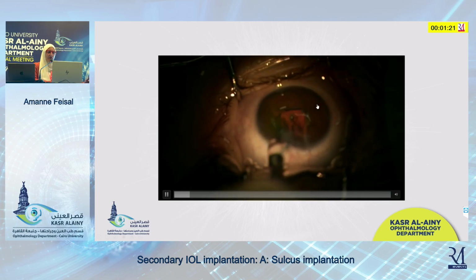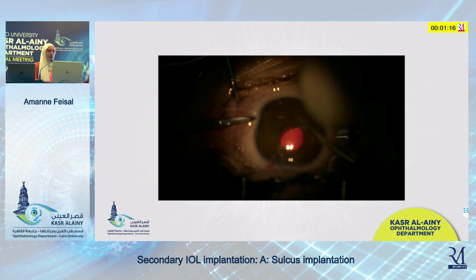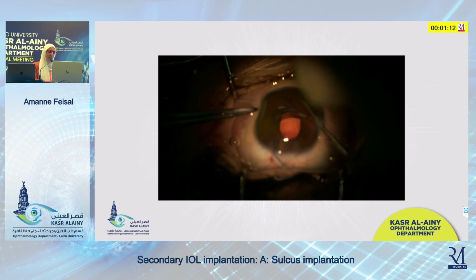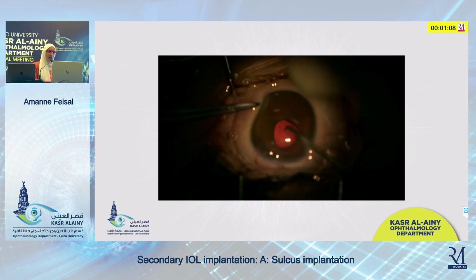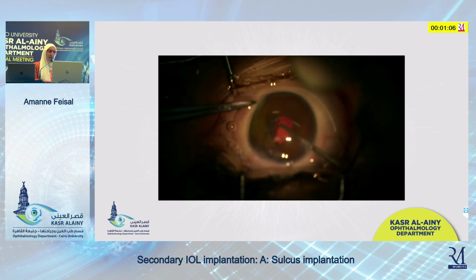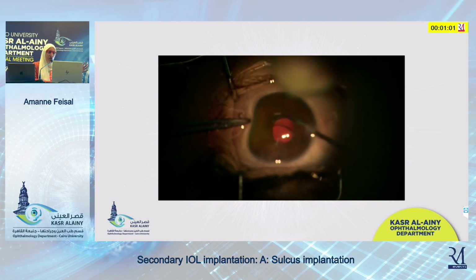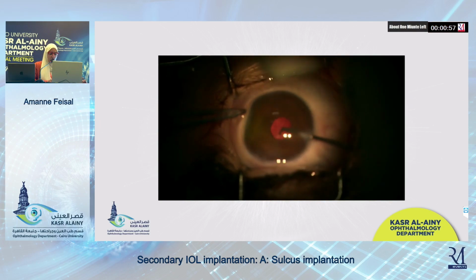Here we have a different situation where we had posterior synechia, and after the assistant lecturer released them, the pupil went down. So what he had to do, he injected the IOL in the anterior chamber, and then using a push-pull, he grabbed the haptic and released it into the sulcus, allowing it to spring in, dialed the IOL, and did the same with the trailing haptic.